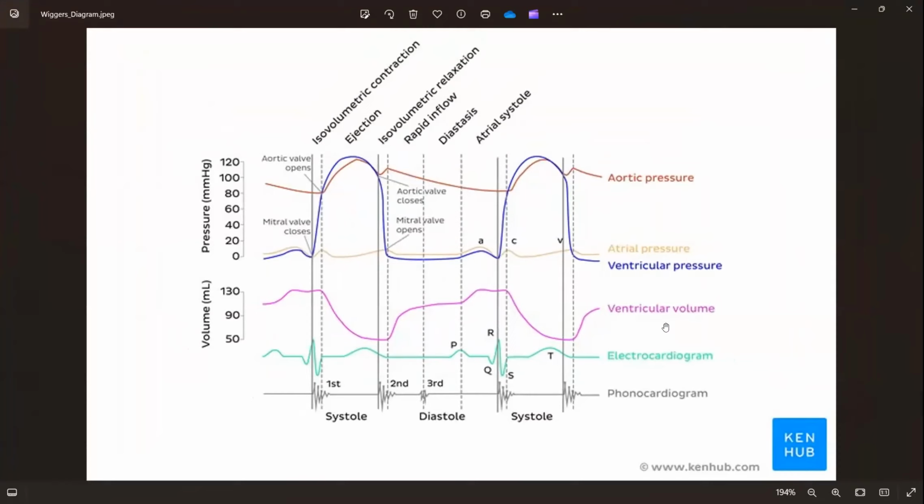Can you see? Yes, sir. So this is your electrocardiogram, ECG, and this is not the only measure. Phonocardiogram is the sound. You hear the sound only during this peak portion, where you hear the most sound. And this is the pressure. When this peak comes, that is the ventricle position. After this signal, this is the highest pressure you get, which is from the ventricular contraction.